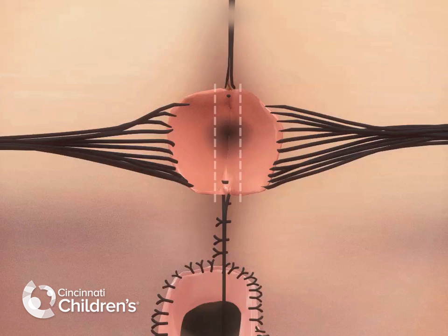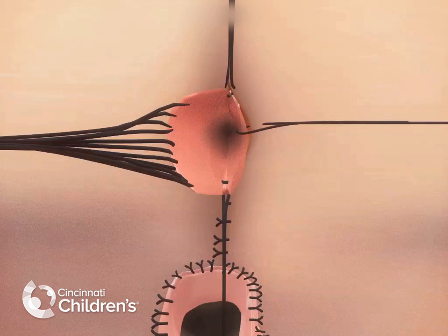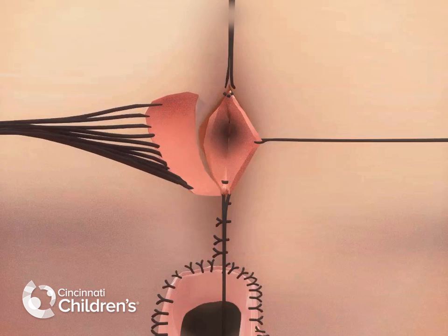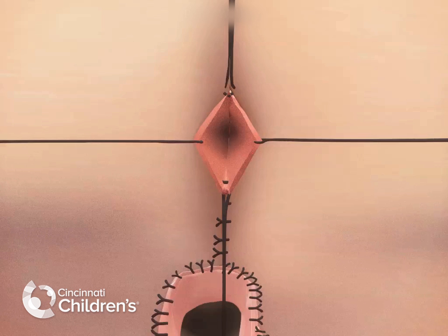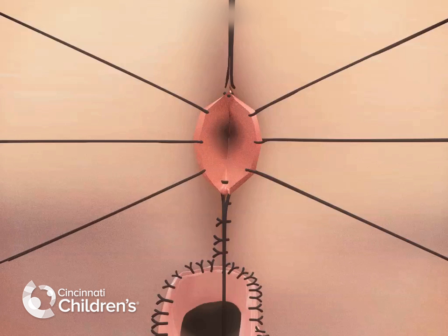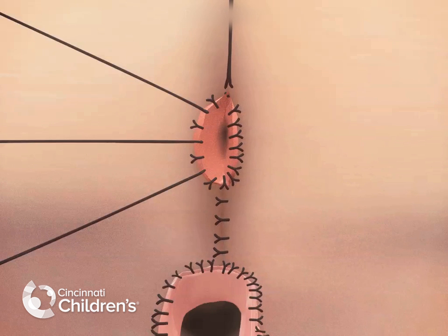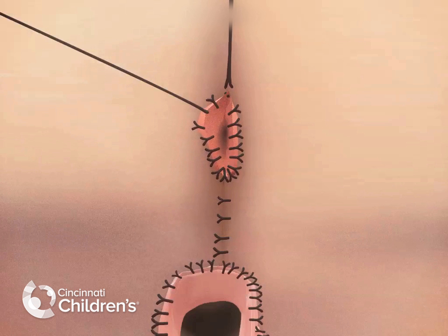The excess rectal tissue is then excised. The remainder of the anoplasty is completed with multiple long-term absorbable sutures, evenly spaced circumferentially around the rectum. As the sutures are cut, the anus retracts into its position in the gluteal cleft, completing the operation.